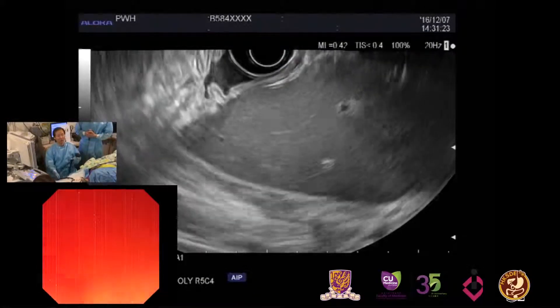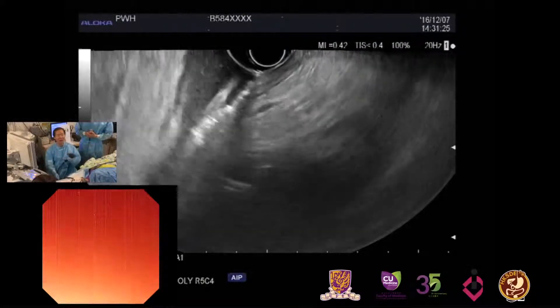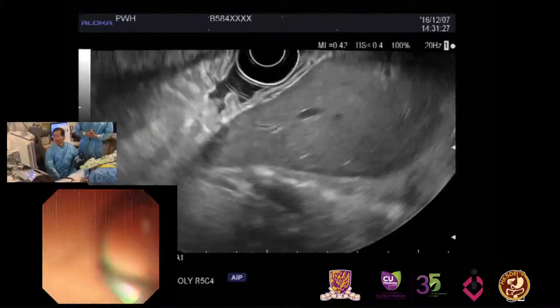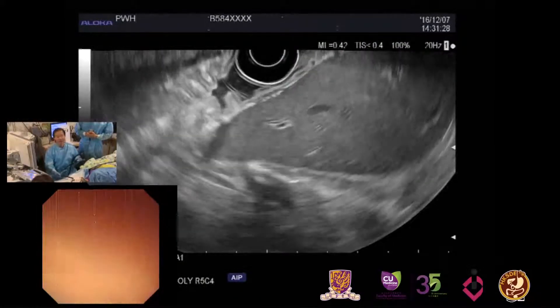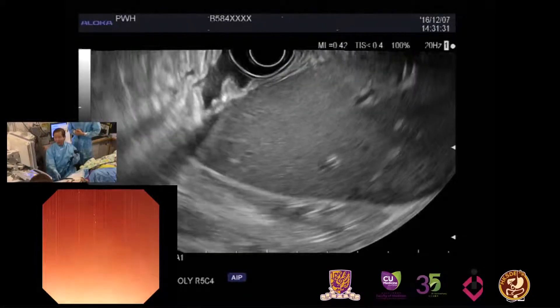My nurses never give me the radial scope — just linear. I follow that order.